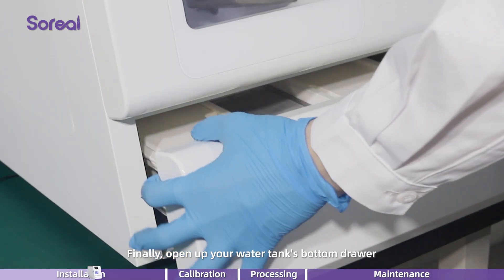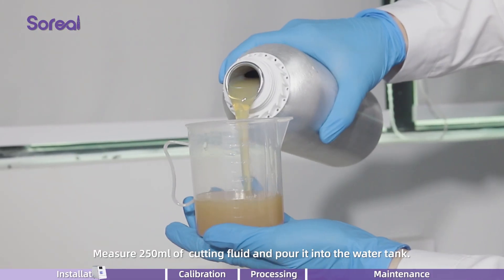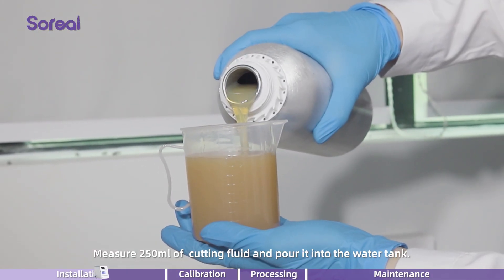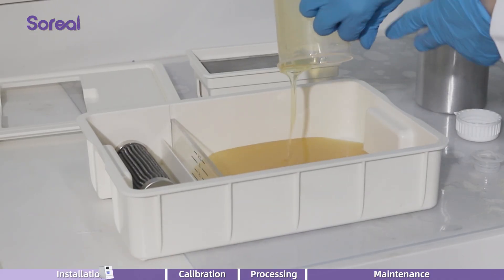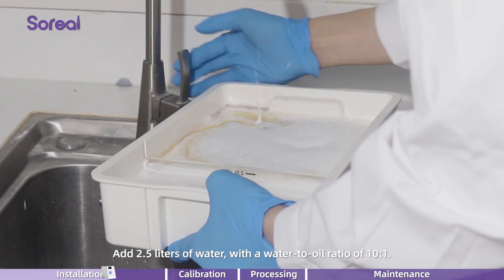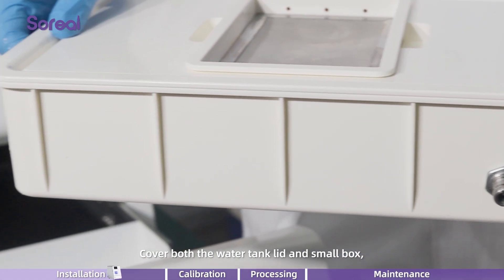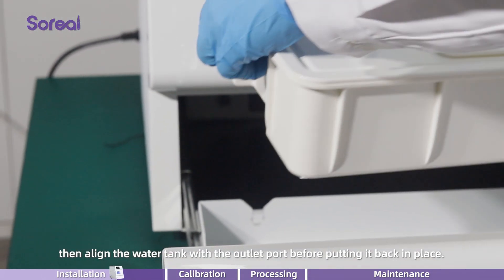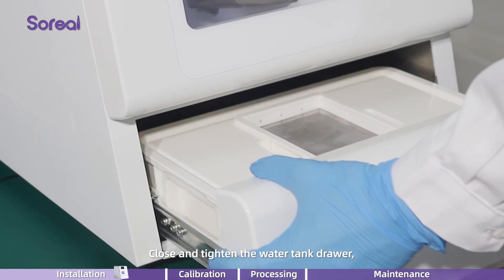Finally, open up your water tank's bottom drawer and remove its water tank when necessary. Measure 250 milliliters of cutting fluid and pour it into the water tank. Add 2.5 liters of water with a water to oil ratio of 10 to 1. Cover both the water tank lid and small box. Then align the water tank with the outlet port before putting it back in place.